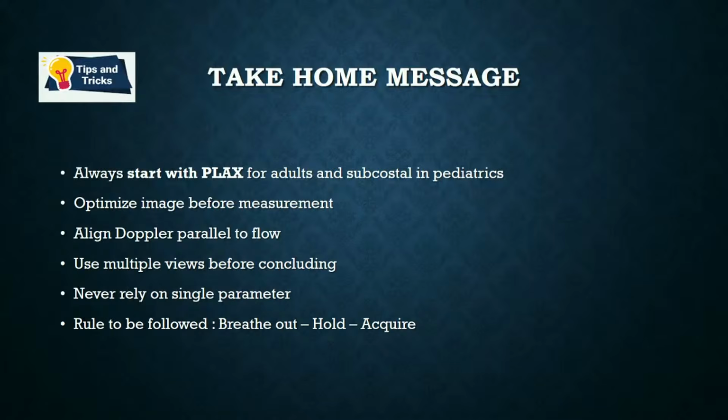Use multiple views before concluding. Never rely on one single parameter. Last but not the least, if you're not getting a good window, ask the patient to breathe out, hold, and acquire your image. Thank you.